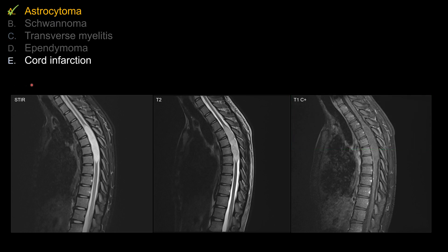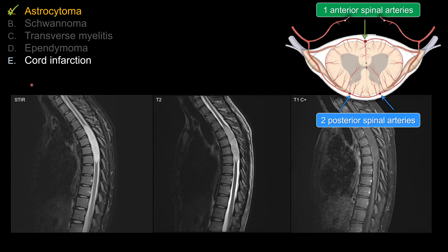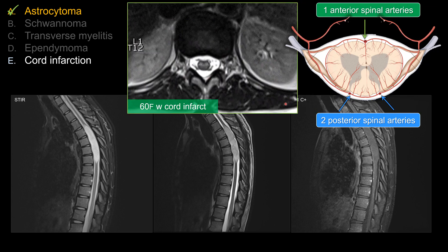For choice E, cord infarction: remember the patient's presentation is progressive weakness? That does not fit, because cord infarction should be a very rapid acute event, not progressive weakness. Also, imaging-wise, spinal cord blood supply anteriorly is from one single artery and posteriorly from two posterior spinal arteries. Therefore, the majority of acute cord infarctions tend to involve just the anterior two-thirds of the cross-sectional area. Often you will see involvement of the gray matter looking like owl's eye or snake eye appearance — not this expansile, whole cord involvement, which would be very atypical for cord infarction.